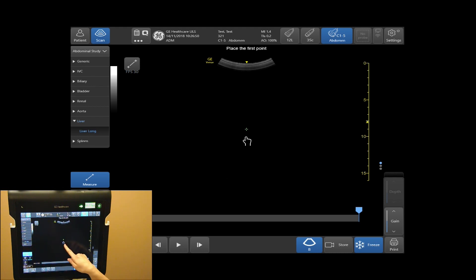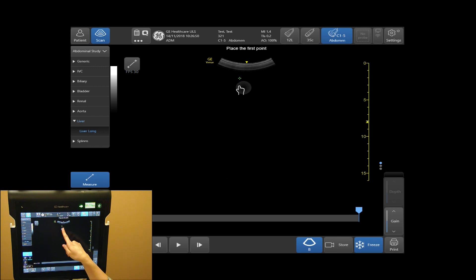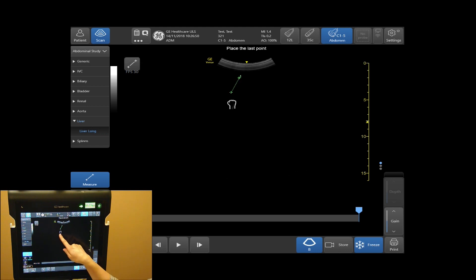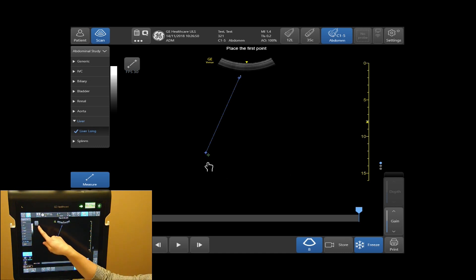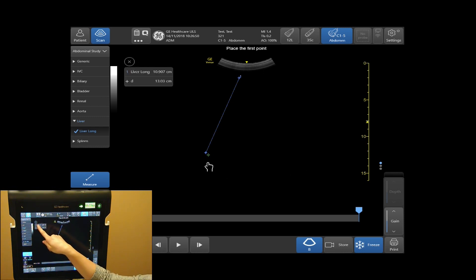Tap on your hand to move to its desired location. Tap to set your first point, then drag your hand and tap on your second to lock your measurement in. If your measurement does not display, tap on your measurement icon that appears on the left-hand side of your touch screen and your liver length will be displayed.